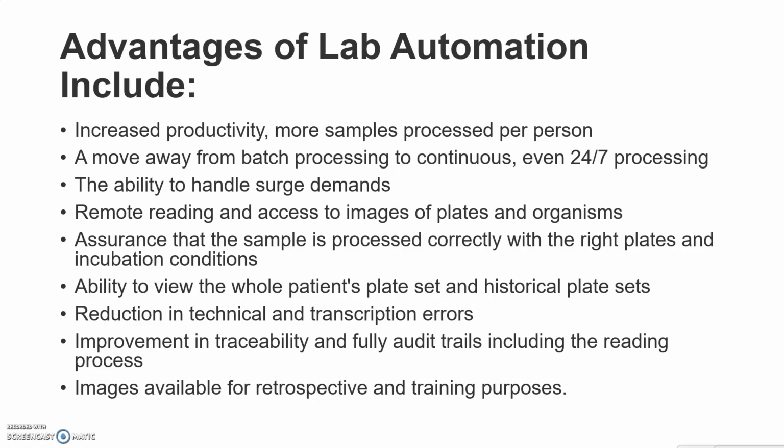So these are all about the automated machines in the microbiology laboratory.